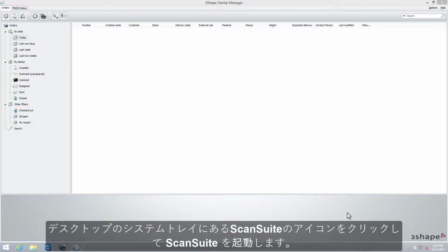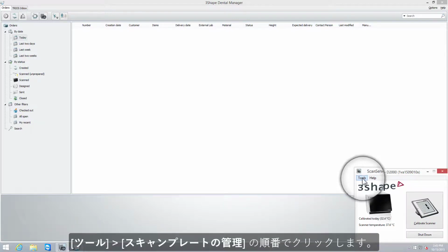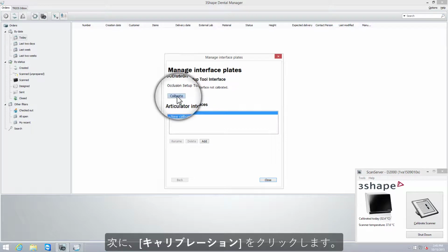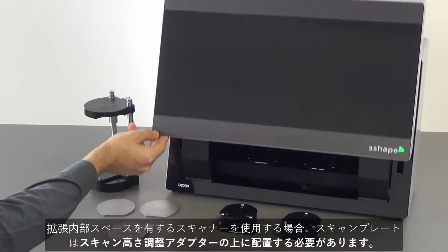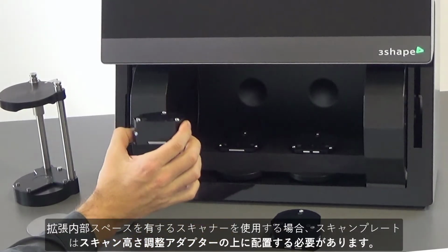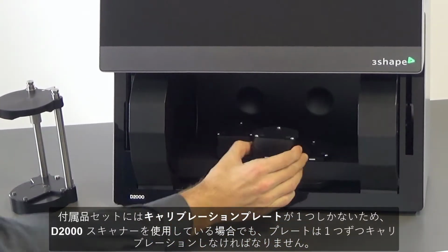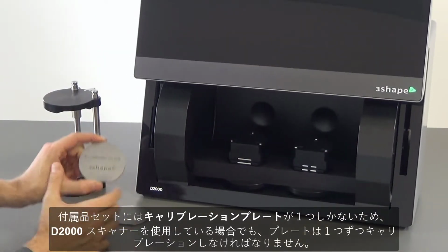Before use, the Occlusion Setup tool and its interface plates need to be calibrated. To do that, open Scan Suite by clicking on the Scan Suite icon in the system tray. Select Tools to open the Manage Interface Plates dialog window. Then click Calibrate. A new pop-out window will show you how to place the plates in the scanner. If you are using a large interior scanner, the plates need to be situated on the scan height adapter. The plates are always calibrated one at a time, even if you are using the D2000 scanner, since there is only one calibration plate in the set.